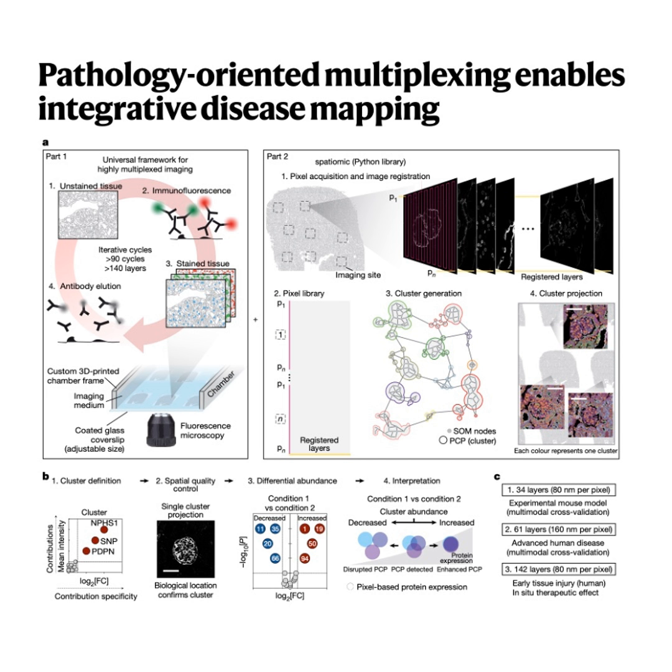Okay. Let's talk about the ultimate goal for this kind of tech, catching disease really early, before it even shows up on a standard pathology report. Did PathoPlex look at patients with type 2 diabetes who technically didn't have kidney disease yet, based on histology? Yes, this was a critical application. They used the full 142 marker panel at 80 nm resolution on biopsies from T2D patients who had no overt signs of DKD, according to traditional microscopic examination. Could PathoPlex see anything amiss?